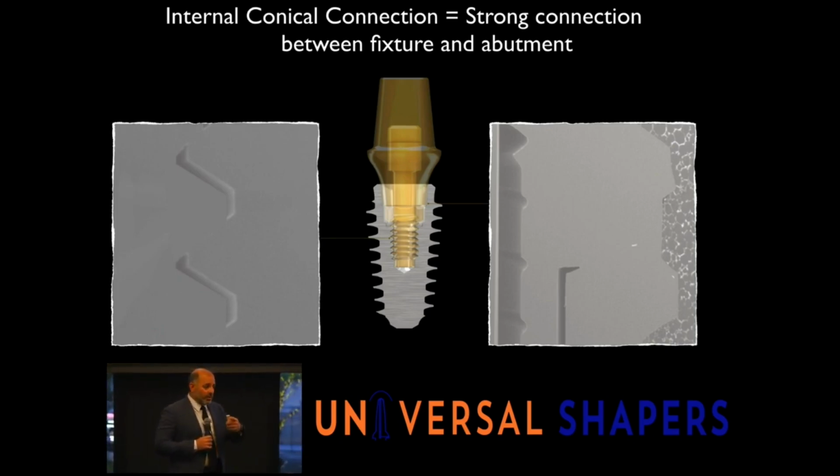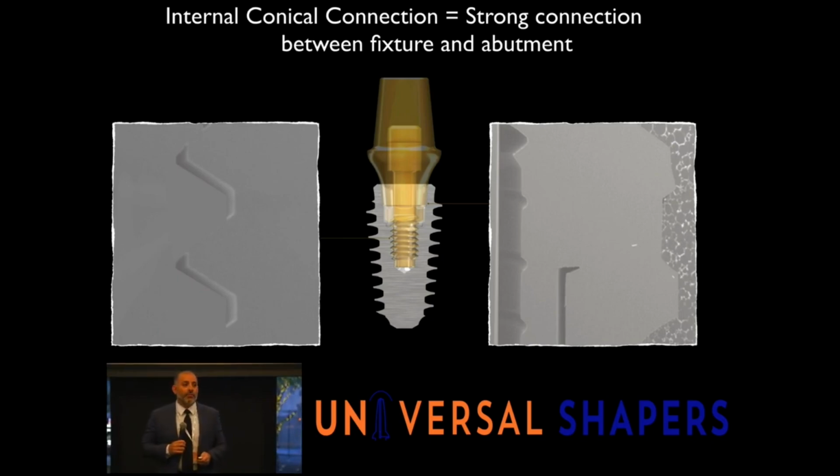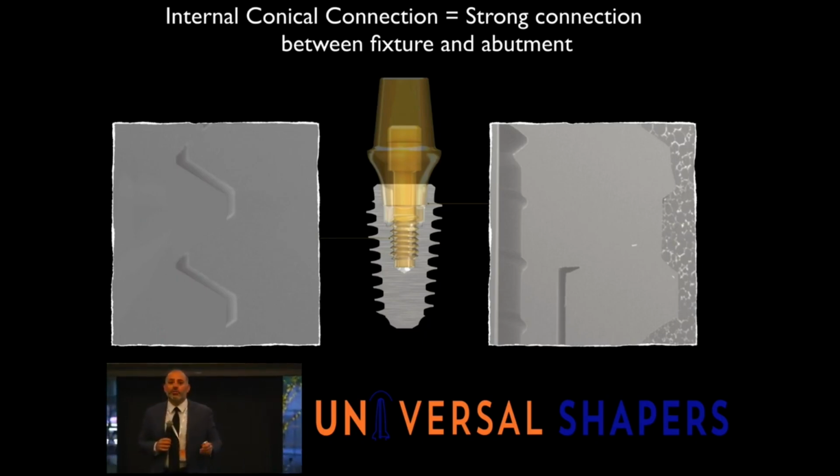And besides the implant we're using today, there are other companies here that have that. So look at them. I'm not trying to sell you an implant. I'm trying to sell you the concept of keeping this conical connection to reduce the chance of microleakage. Again, using a soft tissue implant, that microgap is now above the tissue or at the tissue, so you really don't have to be as concerned about the microgap in tissue level implants.